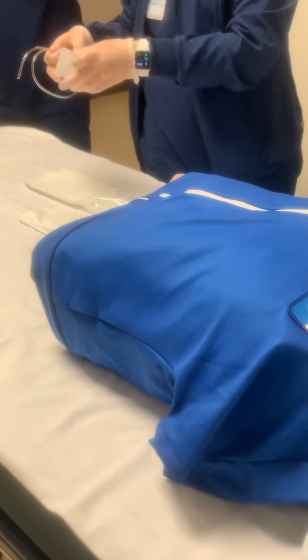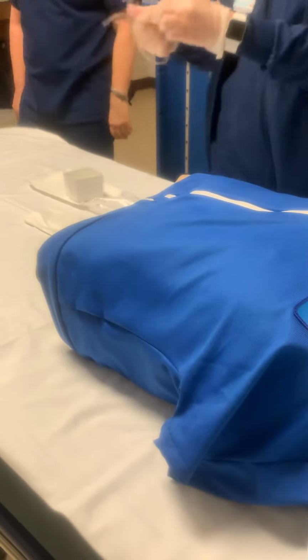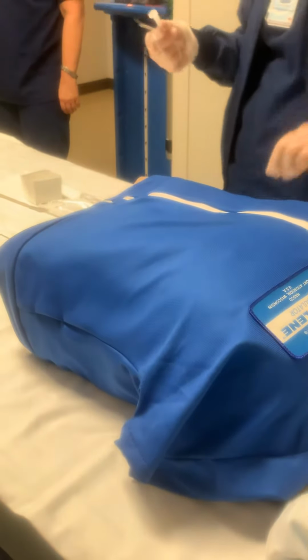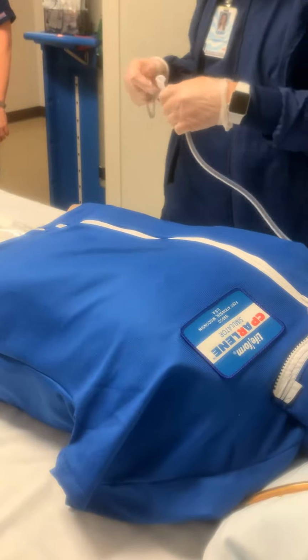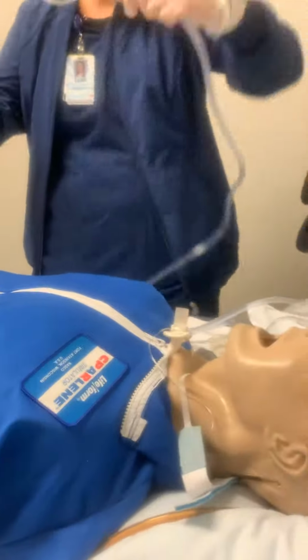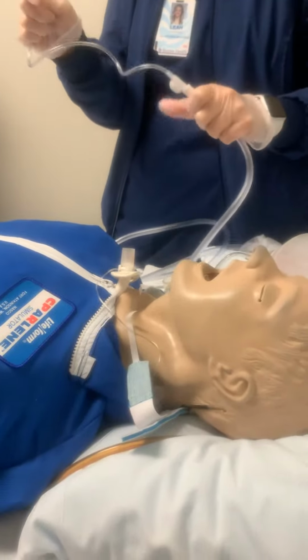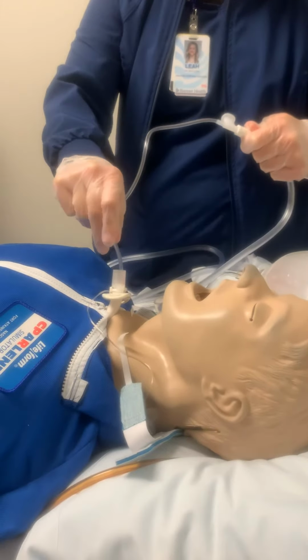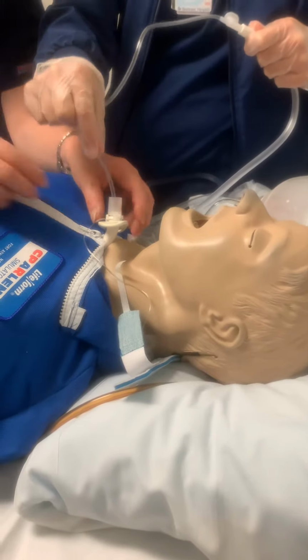Then you can have someone pour some saline in there for you. Don't apply suction. Insert until I meet resistance. Correct. And this one's going to be real shallow, only because it's not buried.